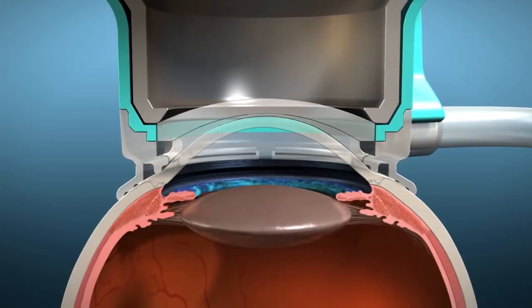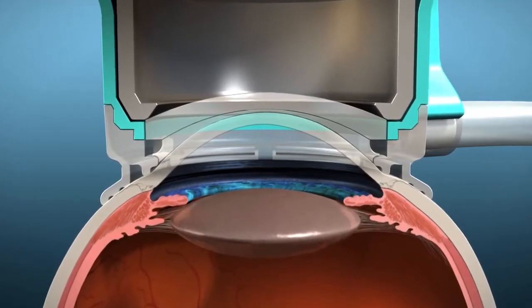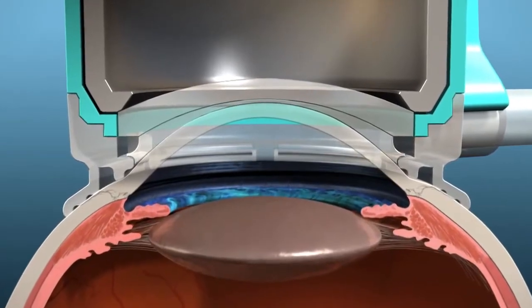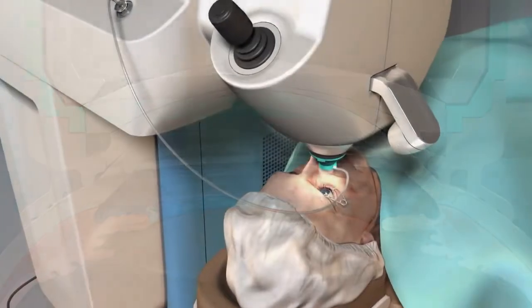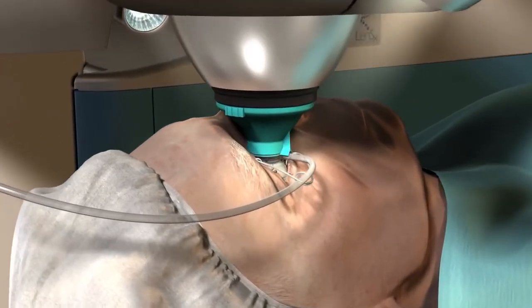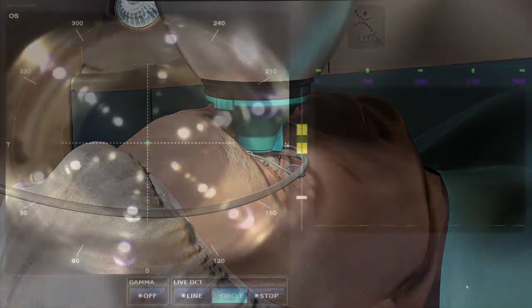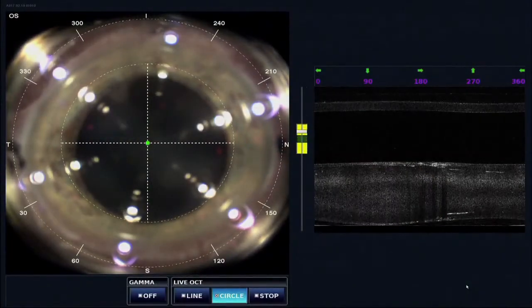The LensX SoftFit patient interface minimizes corneal compression and delivers enhanced patient comfort without a liquid mess. The new Alcon LensX SoftFit patient interface enables simplified docking, especially in small and deep-set eyes. The patient relaxes as the surgeon utilizes the high-resolution video microscope and live HD OCT image to efficiently guide and dock the patient interface to the corneal surface.